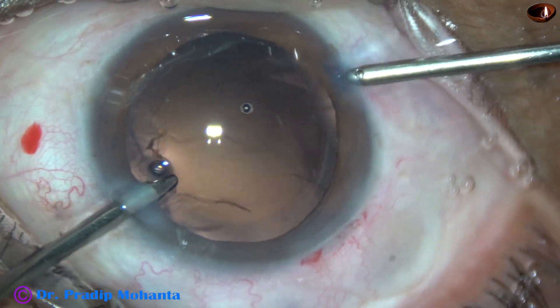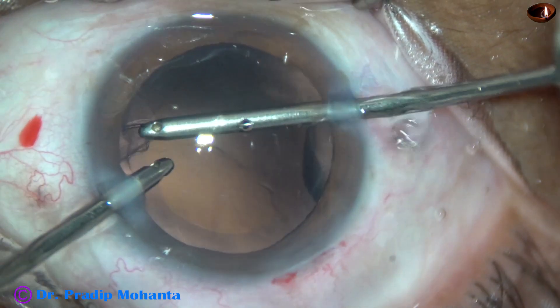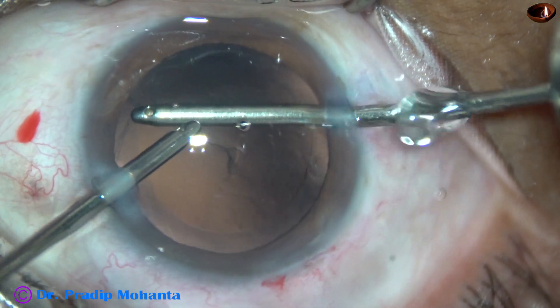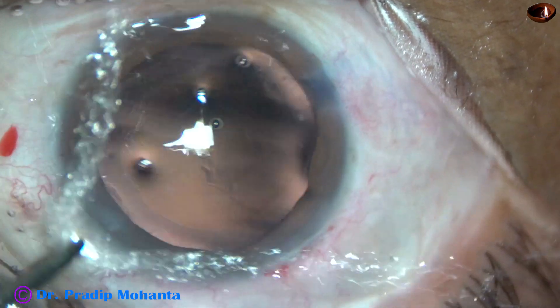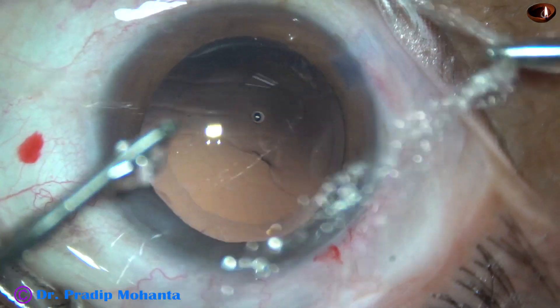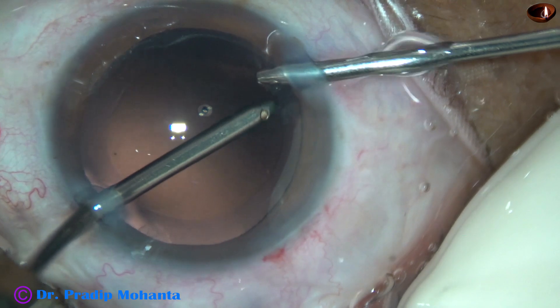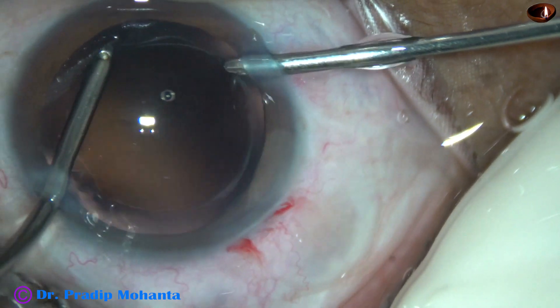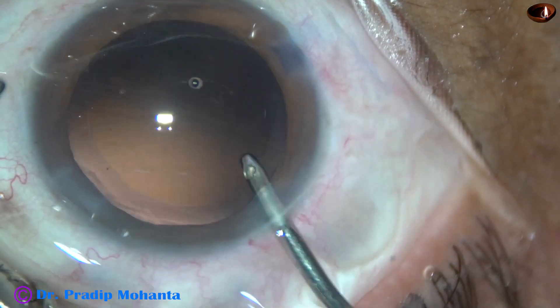Now the irrigation is from the left side and aspiration from the right. With 300 mmHg vacuum, the cortical cleanup is faster. There is hardly any cortex or fibers to be polished, but there is some cortex here and there, which is removed nicely.